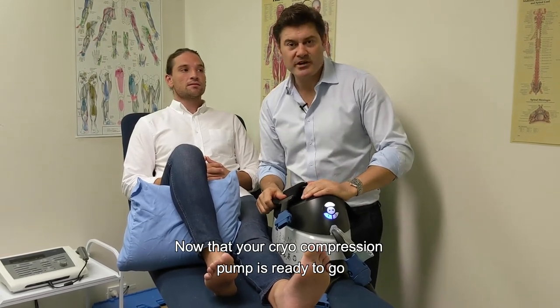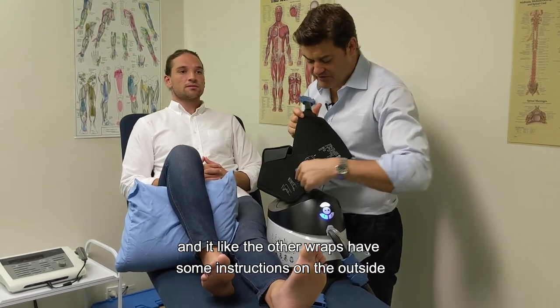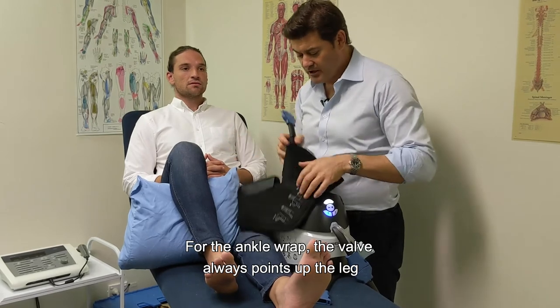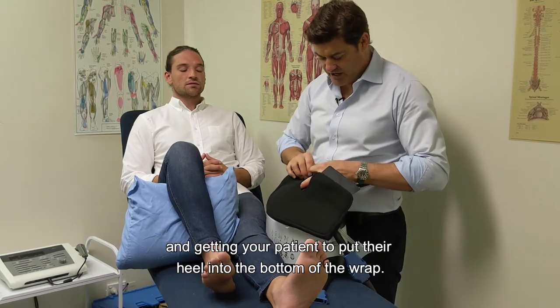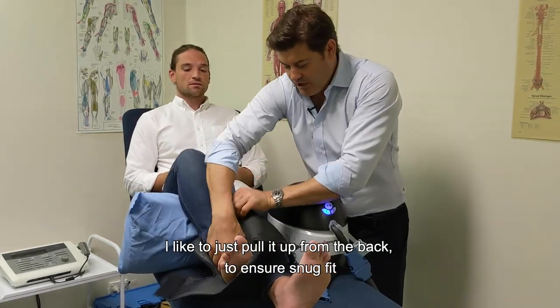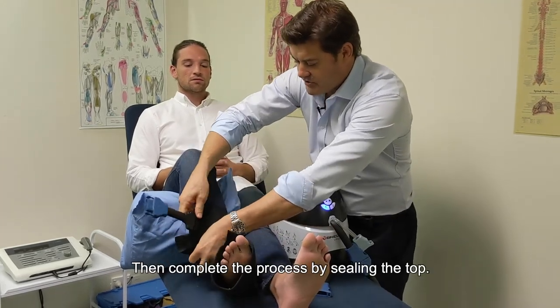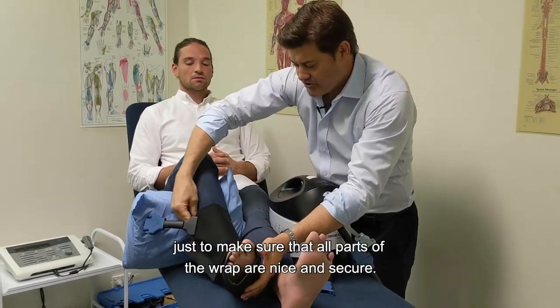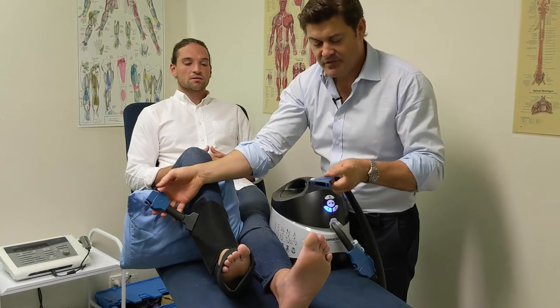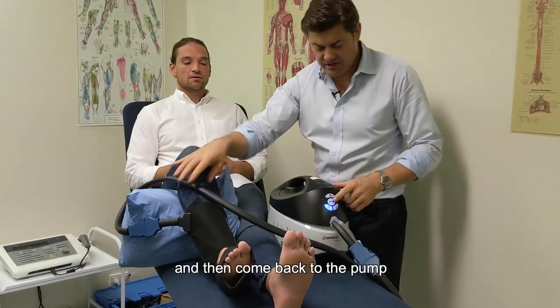For the ankle wrap, like the other wraps, there are instructions on the outside as a reminder. The valve always points up the leg. Open the velcro on the wrap and have your patient place their heel into the bottom of the wrap. Pull it up from the back for a snug fit, secure the foot, then seal the top. Go back to the foot to confirm all parts are secure. Finally, match the extension hose to the outlet valve — logo to logo — connect snugly, check for no kinks in the line, and return to the pump to begin treatment.